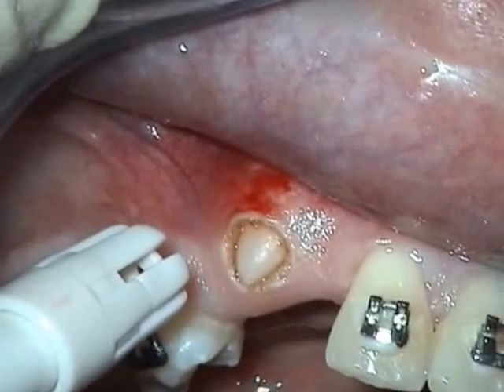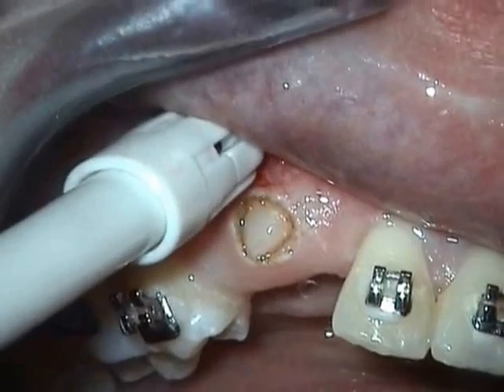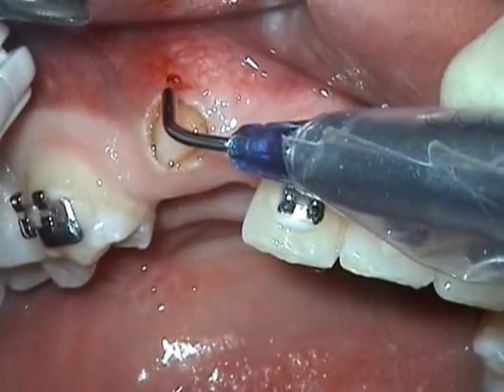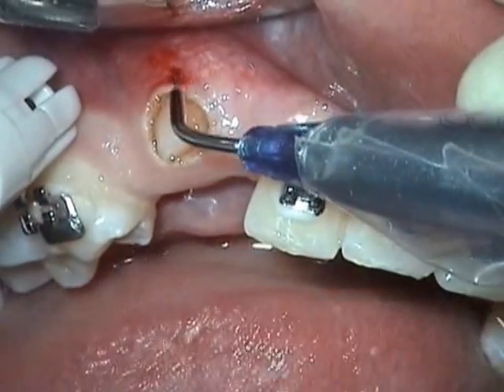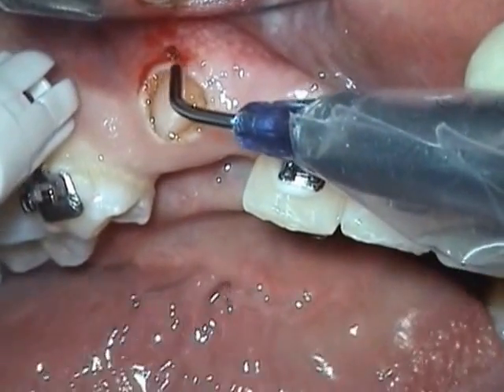There's a little bit of bleeding — I'm just going to cauterize that spot. There's a small area that is bleeding, and this is cauterized just using your fiber in a defocused mode.